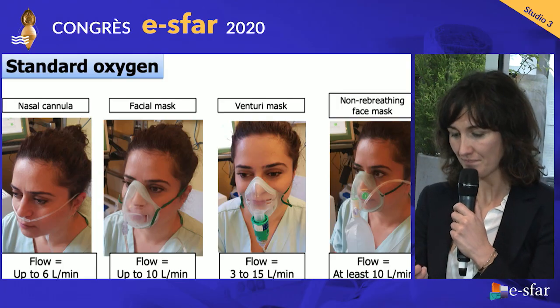Audrey, what are the devices available to take care of the patients? So thank you for inviting me. I mean to talk about the devices available for oxygen supplementation.